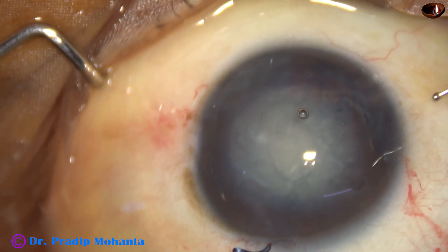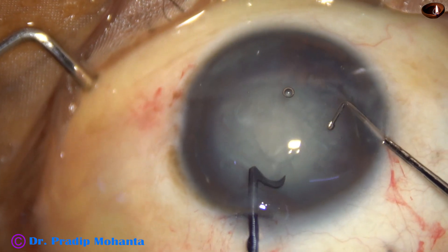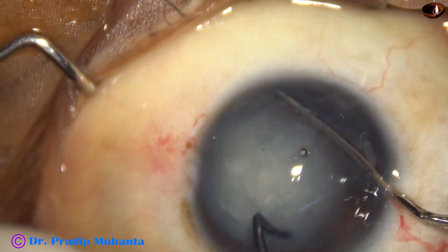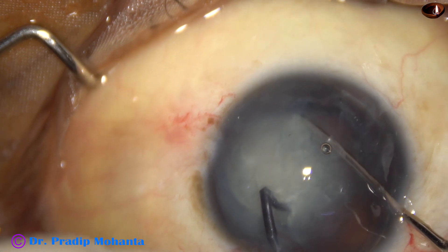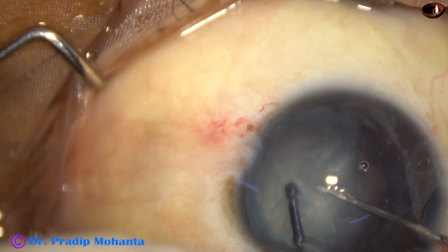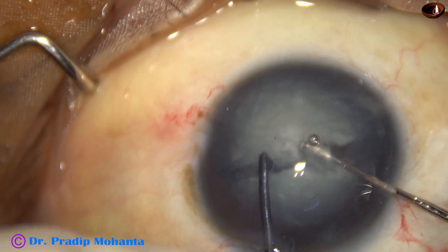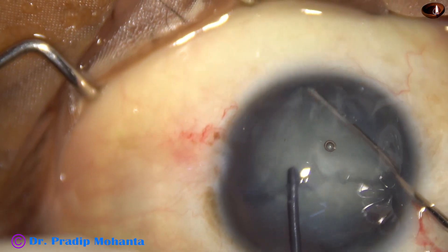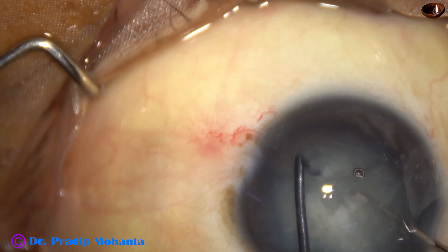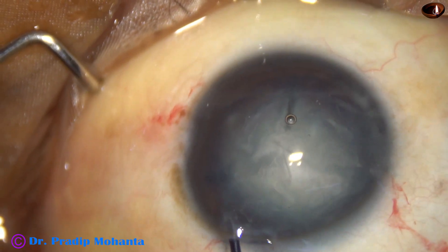And now, I used a pre-chopper to divide the nucleus into two hemi-nuclei in this case. Because in cases with zonular tear, it is always better to use as little irrigation pressure as possible. So, I divided the nucleus into two hemi-nuclei, and I have partially made a crack on one hemi-nucleus.